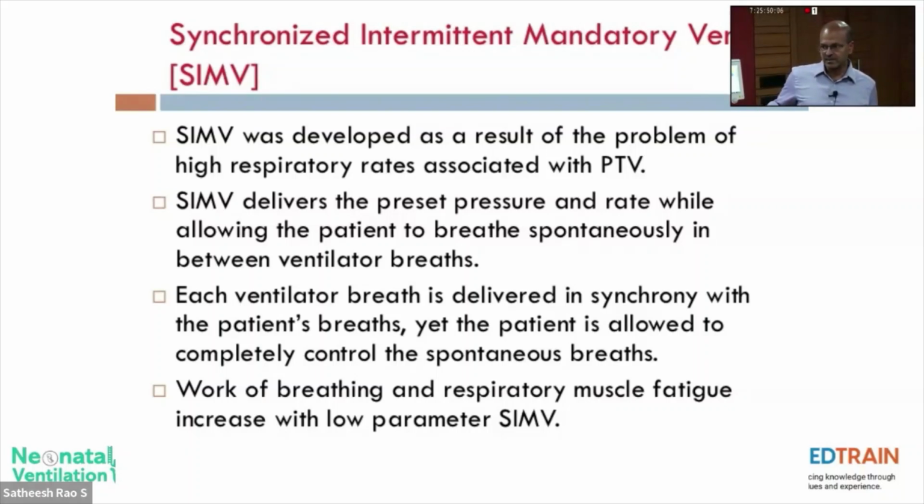Some atelectasis may happen. The baby's physical fatigue, when you extubate, the baby may not be coping with it because they're already tired. So that's the reason that when we go for this, we try to go for PS in addition.